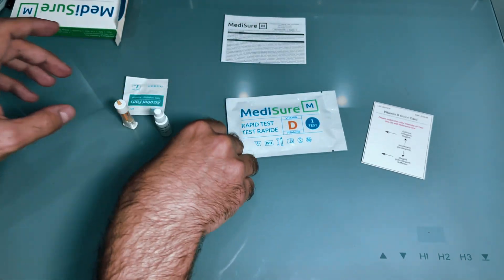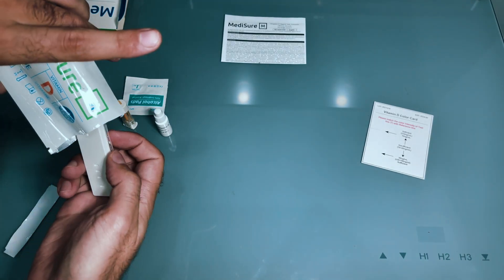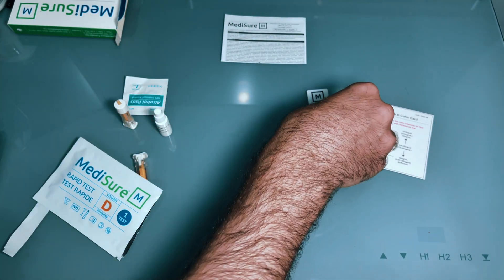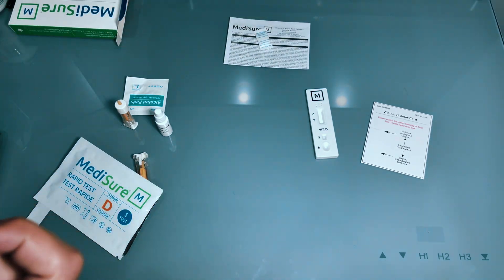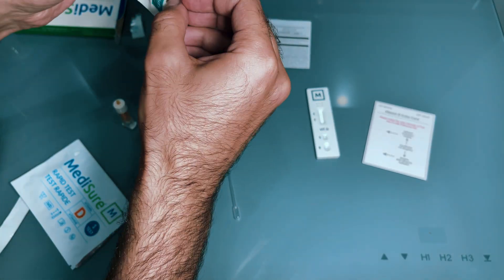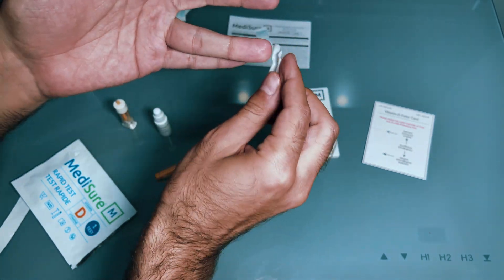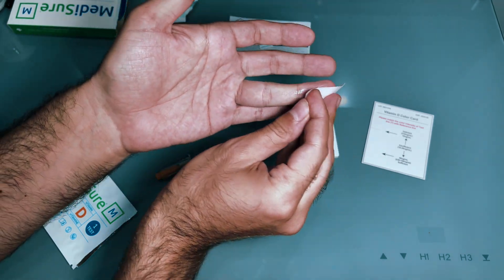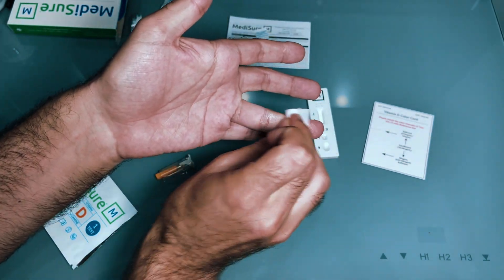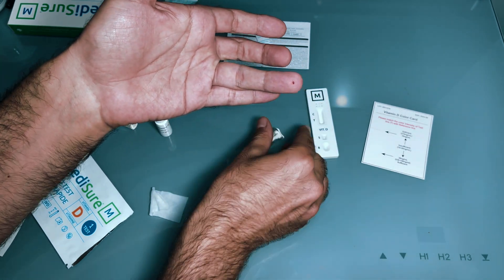First, clean the surface and wash your hands with soap. Unpackage everything including both lancets — if you mess up the first time, you have a second one. The lancet pricks your finger; I recommend using the index finger. It feels like a pinch, doesn't hurt much at all. Clean your chosen finger with the alcohol swab, then push the lancet down onto your finger to get a prick and see some blood droplets appear.